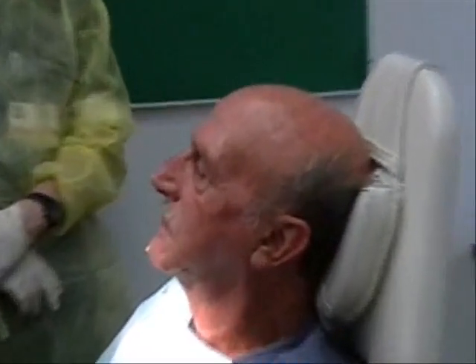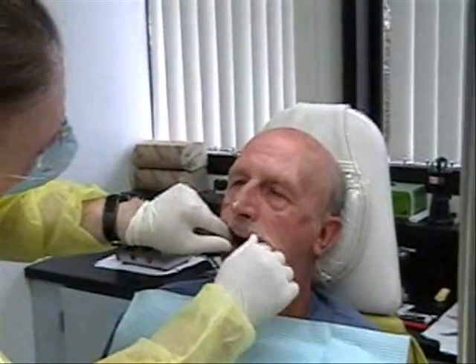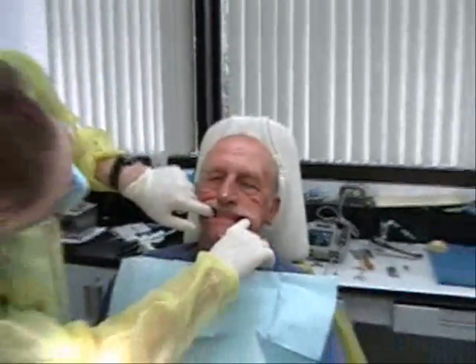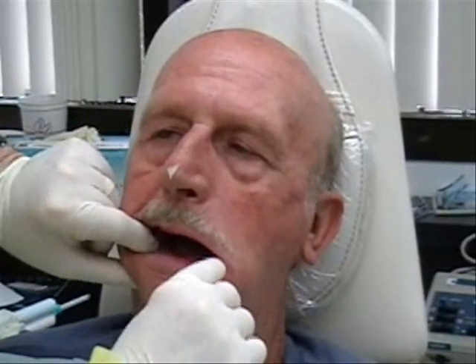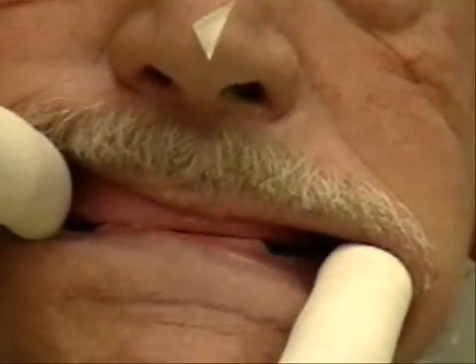Let's get a sense of what we're looking at for profile. We're going to make little notches. We've re-verified our record — we're at the vertical we want to be. Close down a bit. We're not touching back here, we're clear there. But we are touching over here. We're touching on this side — what I want is you only touching in the front. Much better — he's clear here now and he's clear here. Can you see this? That's great. I'm just going to pull your lip back over it.